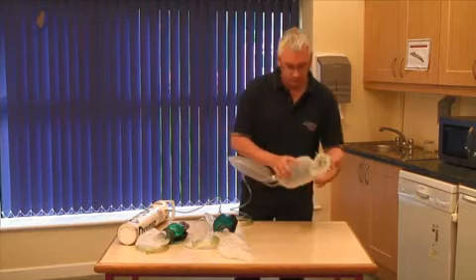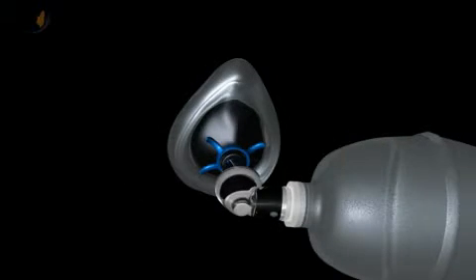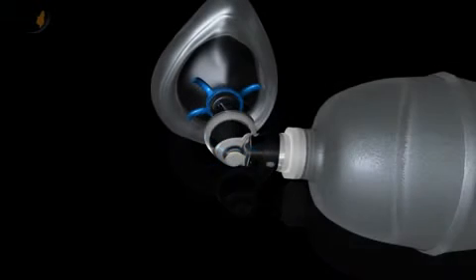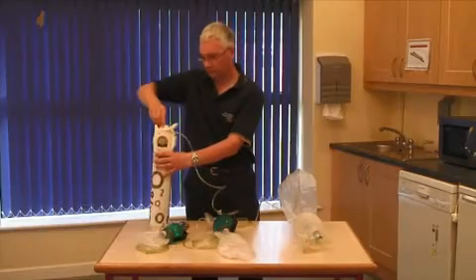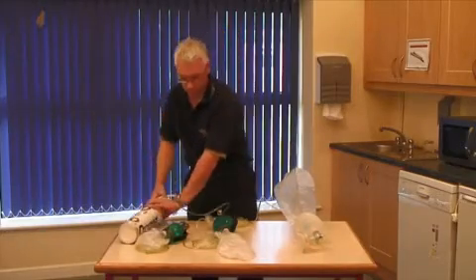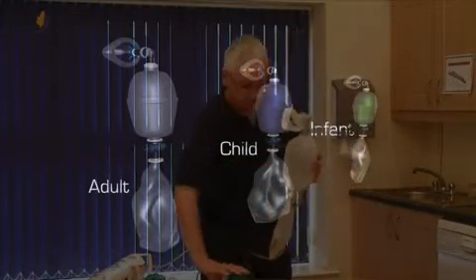A bag valve mask device consists of a ventilation bag and a face mask. The bag contains a valve to prevent re-breathing of exhaled air. The bag valve mask should always be used with oxygen. It comes in three sizes: adult, child, and infant.